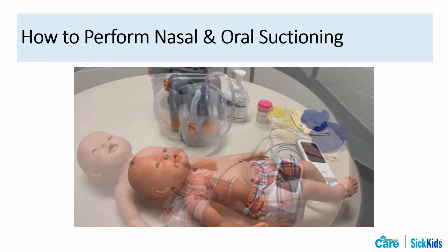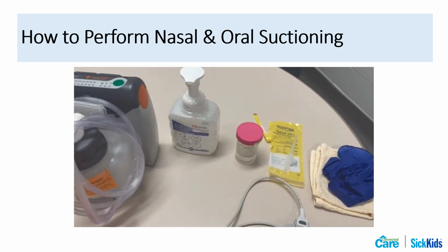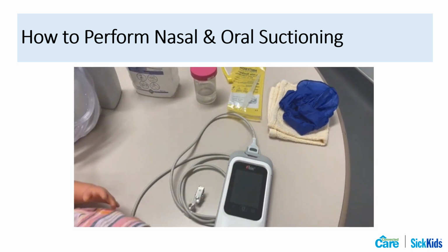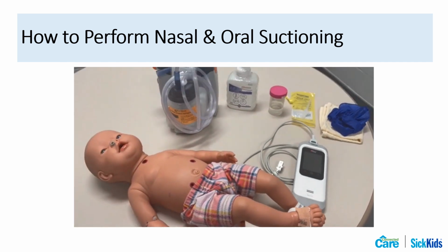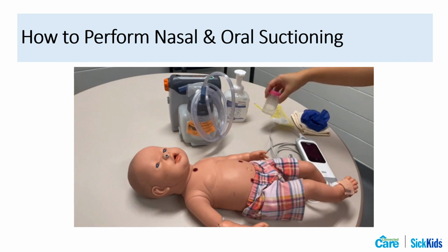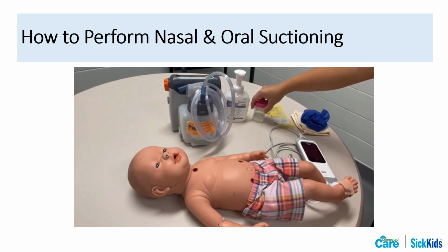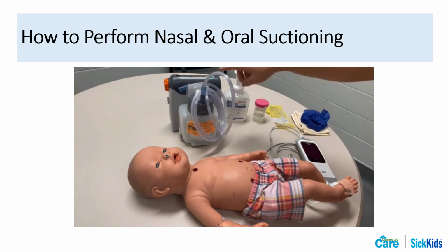This video will demonstrate oral and nasal suctioning. Gather your equipment and supplies and have them nearby. Fill a clean container with sterile water or saline. Ensure your suction machine is set to the appropriate pressure.